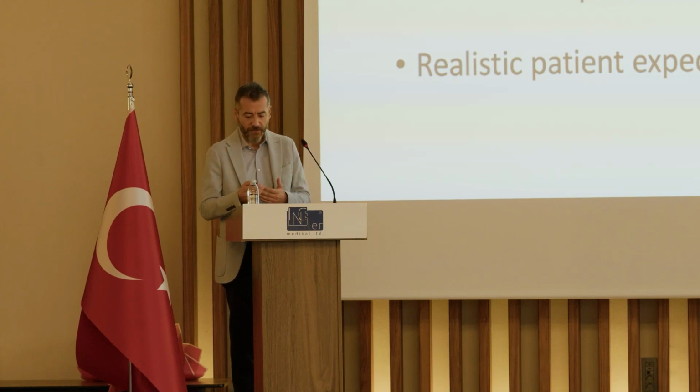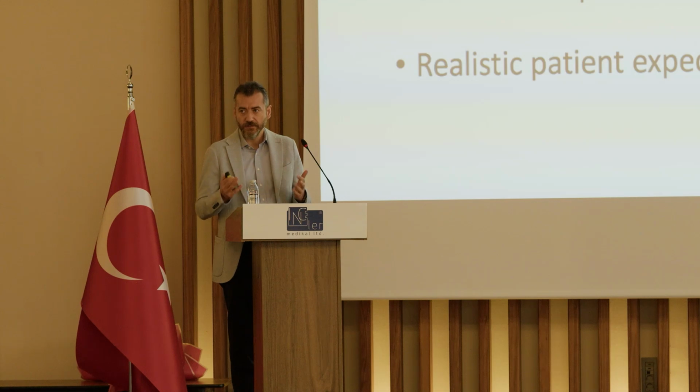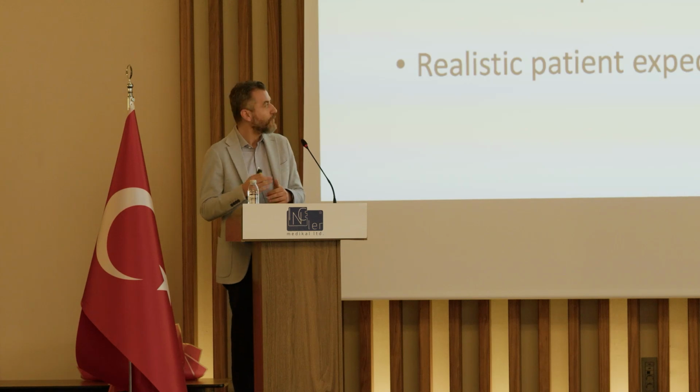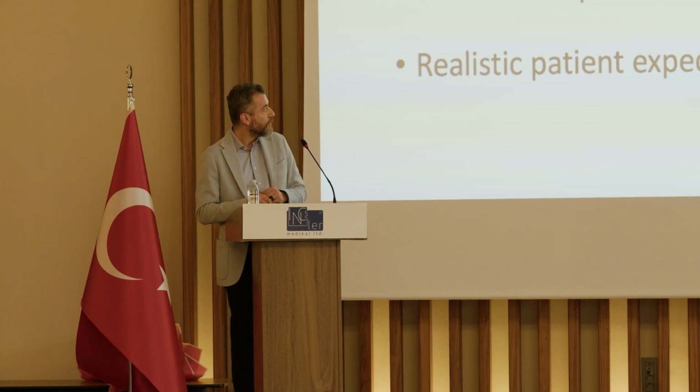so that you will not have a disappointed patient. And the other one is you need to have a dedicated team to apply any surgical procedure. I mean, we do PCNL with a team. We need to have a good technician, a good nurse, or an assistant to help us. But for shockwave, it's also the same. If you just let your technician do the job and do not follow the patient during the procedure yourself, then the outcomes will not be good.